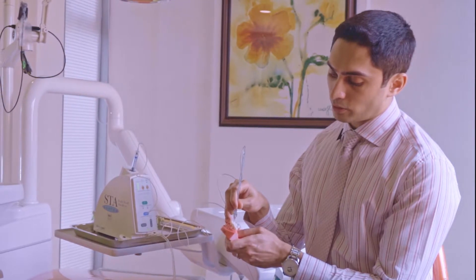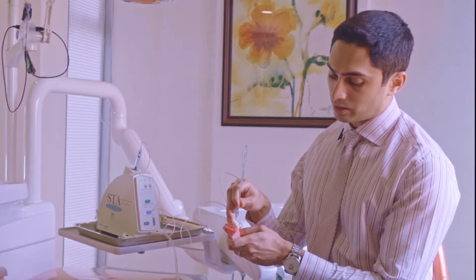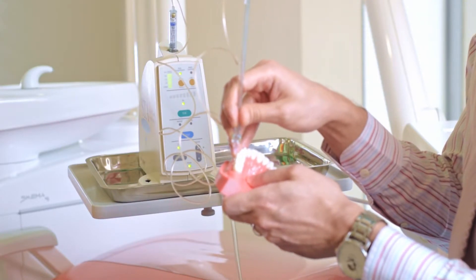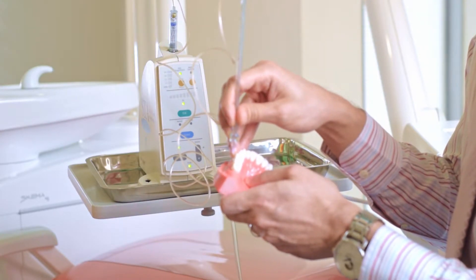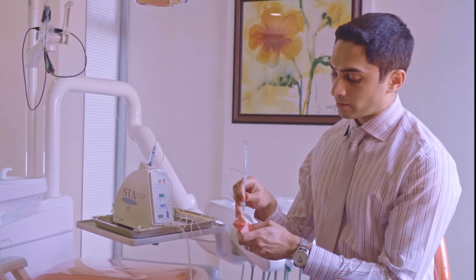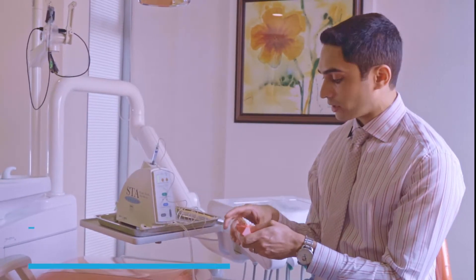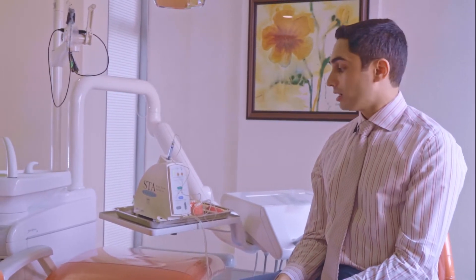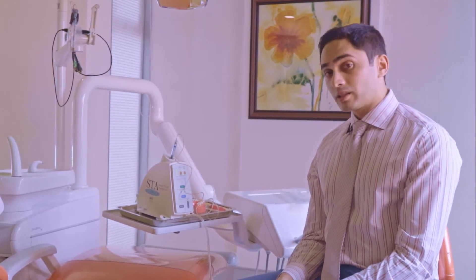You then move to a different location, and by that time the soft tissue is already numb so anesthesia is working well. When you're done, press again and it automatically stops. The main advantage is that it's really painless — most people say they didn't feel any pain at all and didn't even know they received local anesthetic.